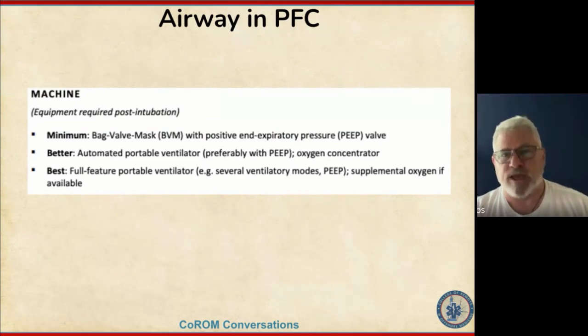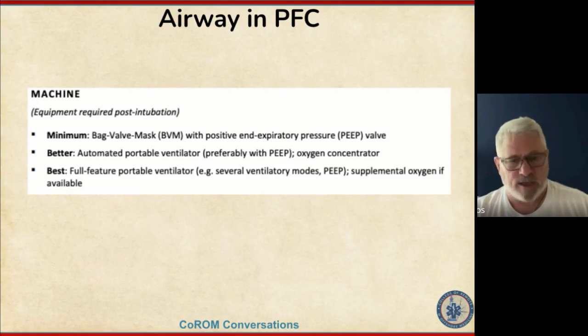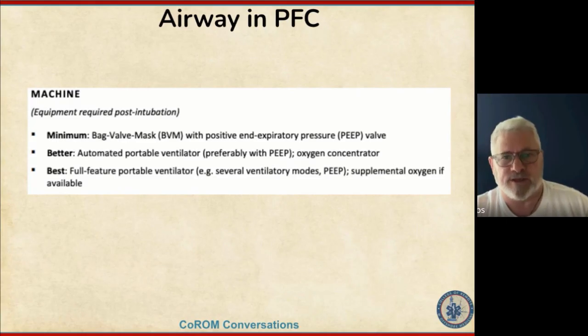So if you know that you can't do it in a calm classroom environment and you have to do BVM on a patient, just start with 2 people. Don't flounder in a real-world, stressful trauma situation when you couldn't even do it in a classroom environment. That's your patient, the one that's not breathing in this time frame. So practice it enough to know your tendencies. Some people, their hands are just too small. They're not able to maintain a good seal on a patient.